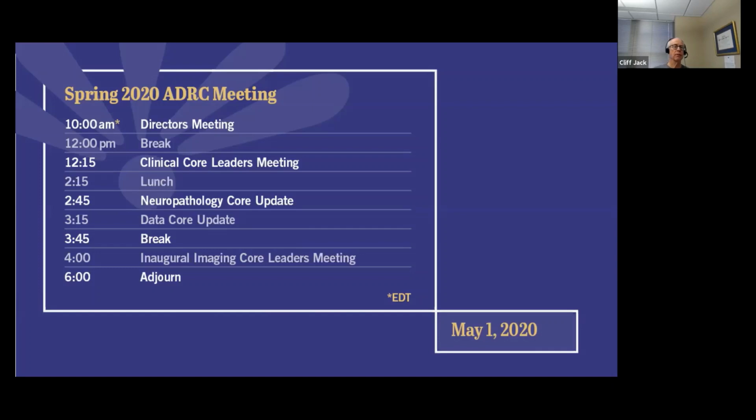So I'm not sure what the question is, but in terms of the MR side, I think that we are going to want to requalify every scanner for SCAN. The reason is that if you already have an ADNI qualified scanner, you're probably going to be a site that's going to do option 1. That is, you're going to strip out the T1 and the FLAIR, and you're going to add a bunch of sequences that you already want to do to the protocol. So you'd be doing a protocol that's actually different from ADNI for SCAN, and so we would want to qualify that. It'll be very simple. You just scan a phantom and send it through.